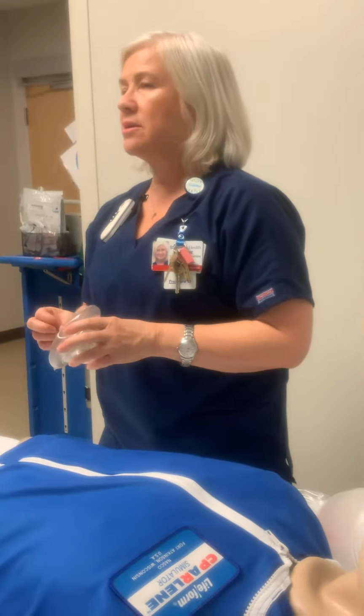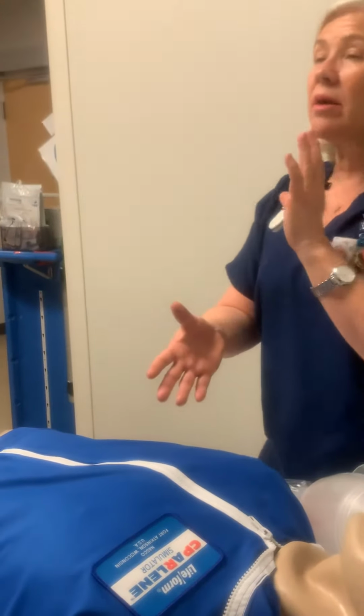So, our patient that we're treating here, would that be the case? Because he's completely swollen. Yeah, in that event, if this trach comes out and he's completely swollen, it's going to be hard to ventilate, then you're going to have to go to the stoma. Okay. Go to the stoma, okay? Because you could do either or.